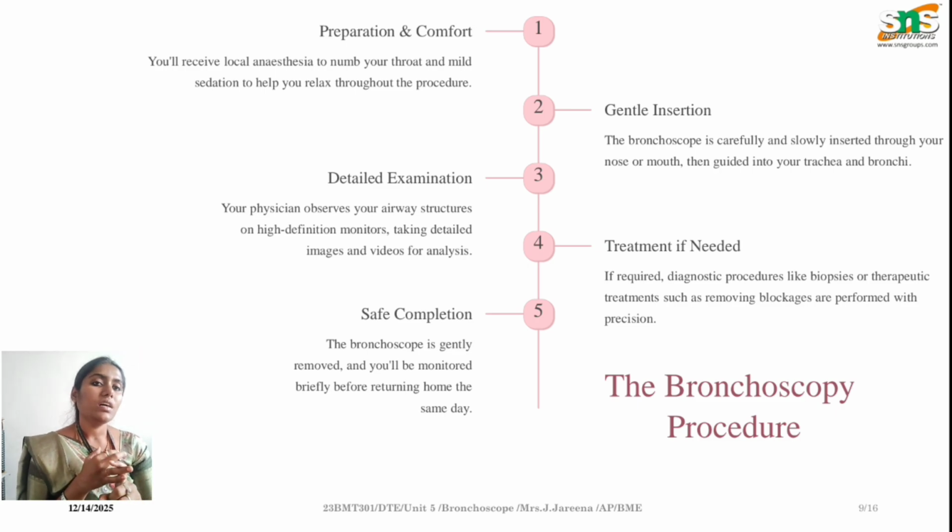Then, following preparation, we have a gentle insertion, where we insert the bronchoscope. We have a lens system which helps to navigate the scope, which is easily guided, and we can keep it in the place where we want to examine.